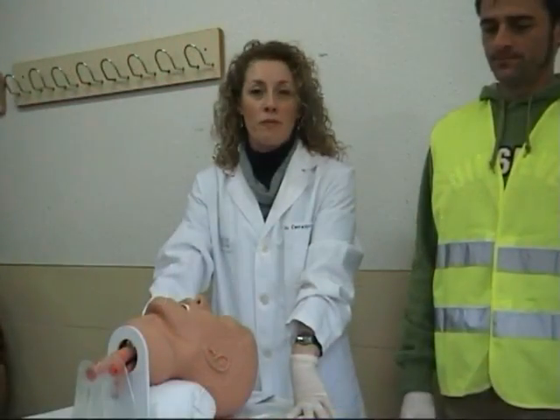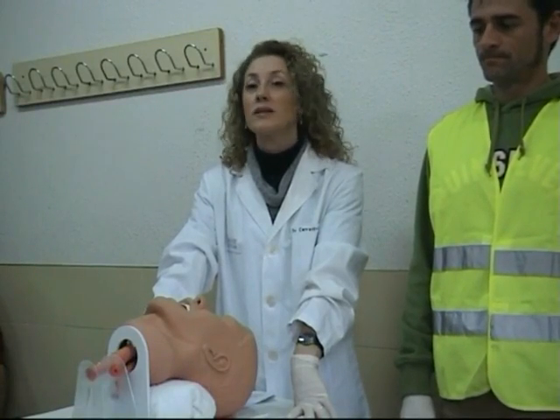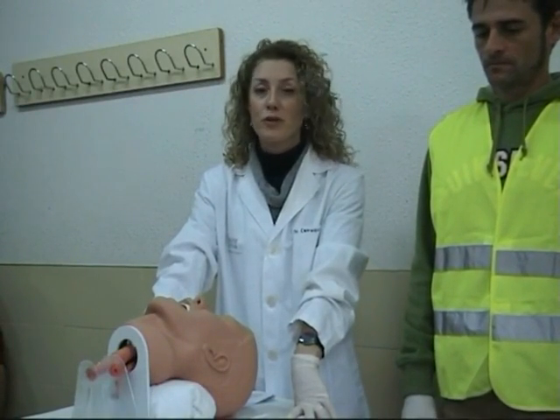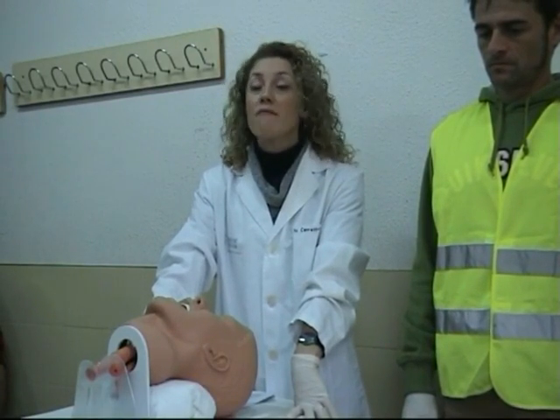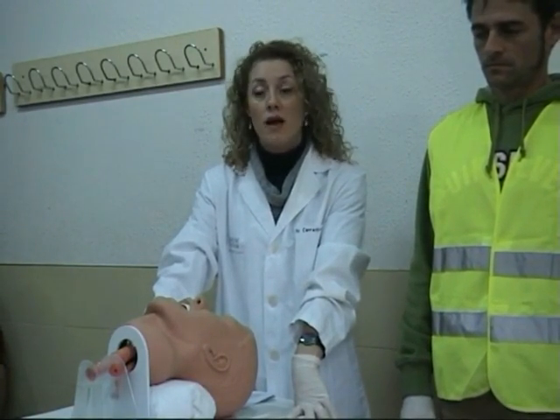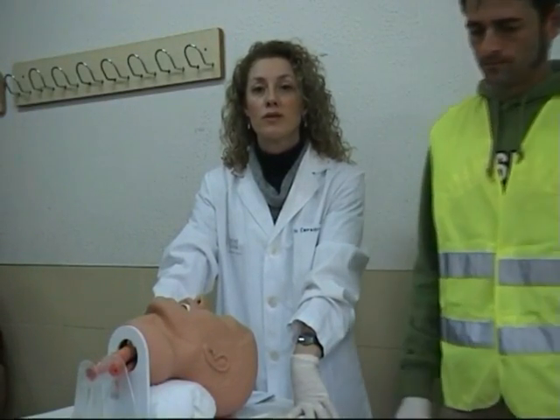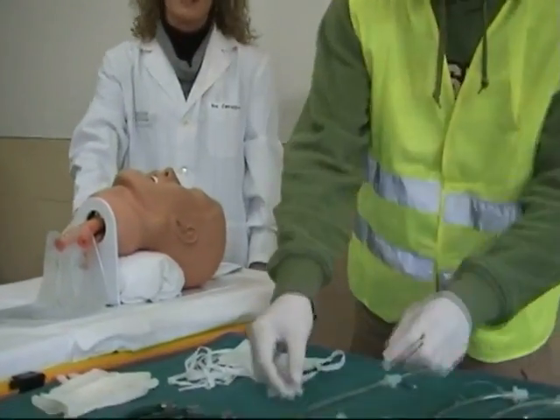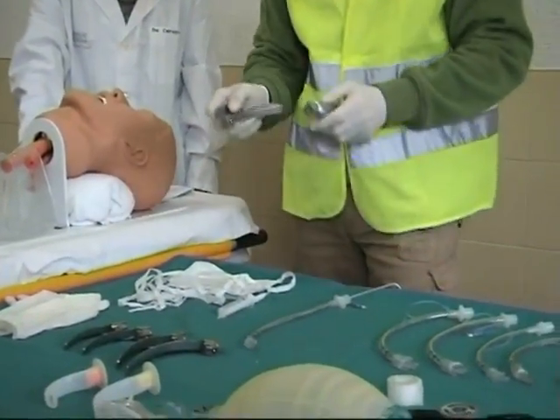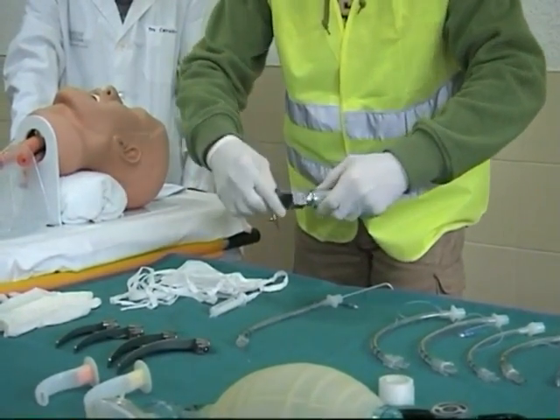After gathering the equipment, the following step is to check it. Before attempting to intubate, make sure that all the equipment is ready and functioning. This task can be performed by a trained paramedic and includes the following: to place the blade on the laryngoscope handle and check the light.